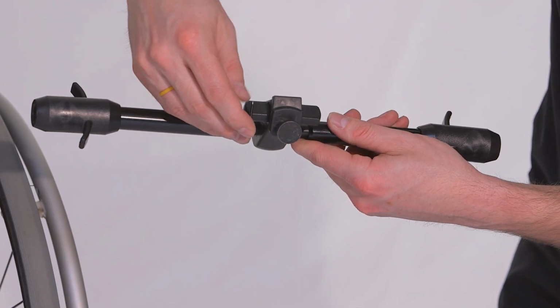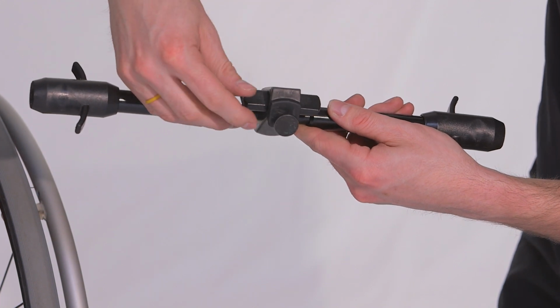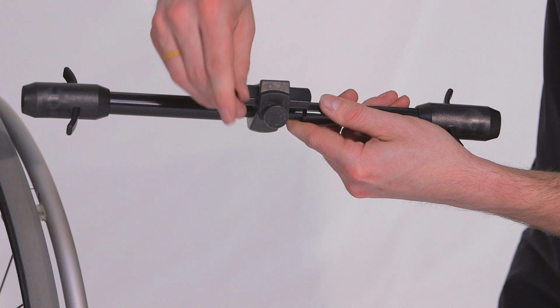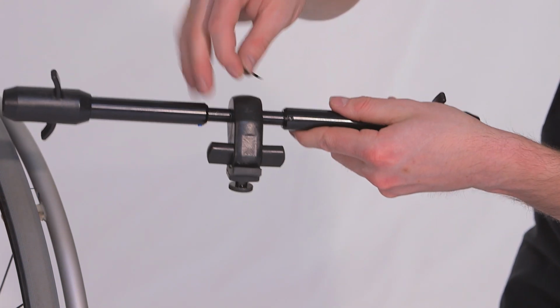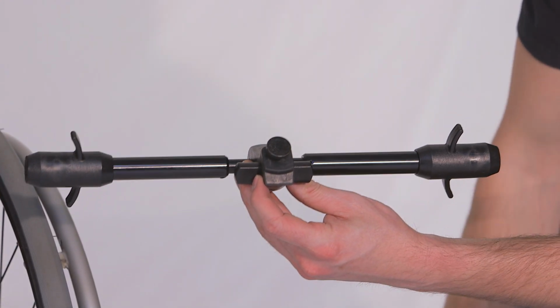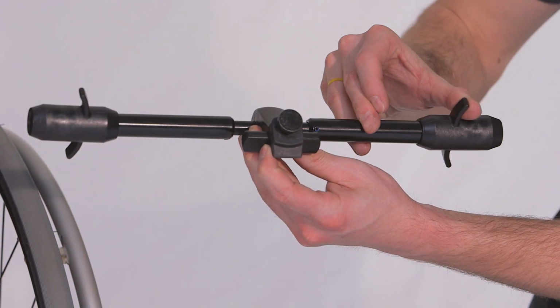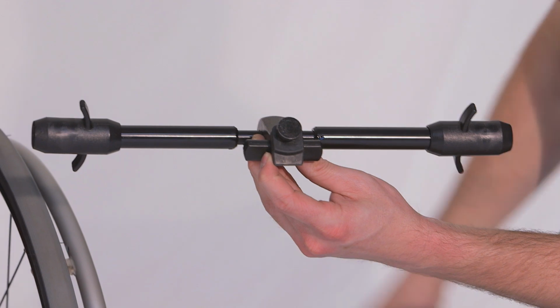With it set up correctly, make sure the 2 dimple set screws are tight. Then, for extra security, be sure to tighten the other 2 set screws in each of the end tubes as shown. Now, the folder adapter bar is ready for attachment to the drive unit, as you'll want the drive unit pre-attached to the bar prior to putting it on the wheelchair.